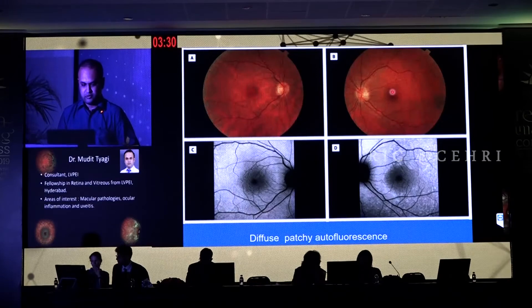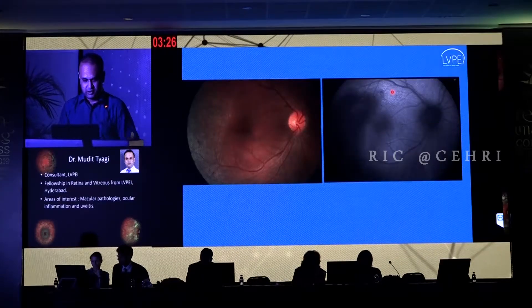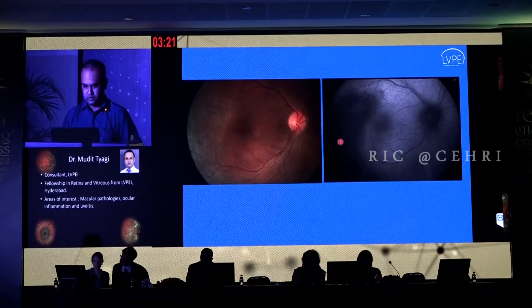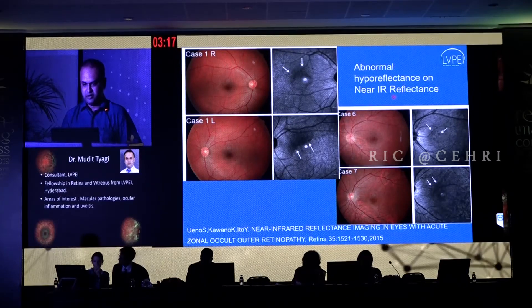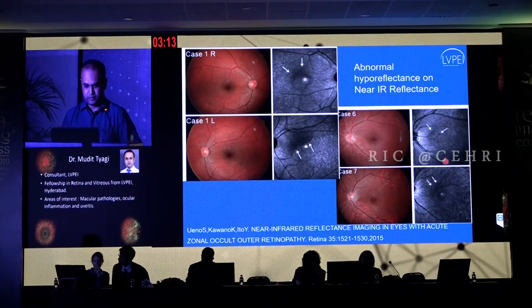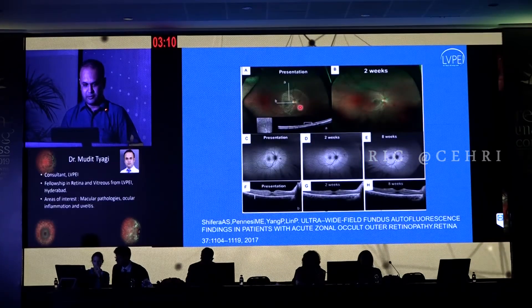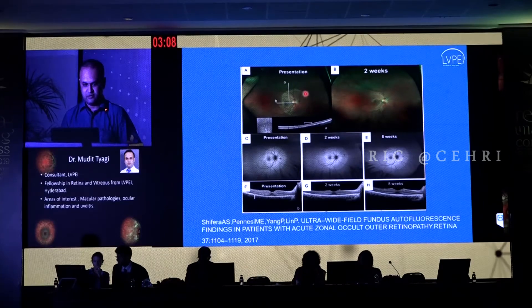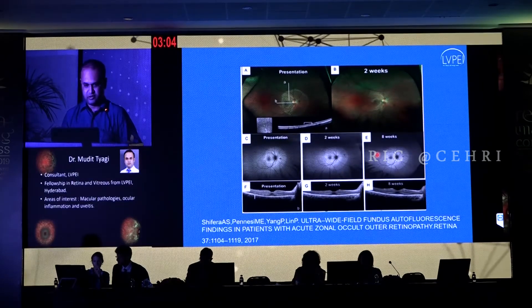Apart from this, you can also see a diffuse patchy autofluorescence in this patient, and this is another one of our patients where you see these pigmentary changes and this patchy autofluorescence. Abnormal hyper-reflectance or near-infrared reflectance is also seen in these patients. Wide-field imaging again shows the presence of these characteristic changes with this demarcation line and autofluorescence changes seen significantly in these patients.